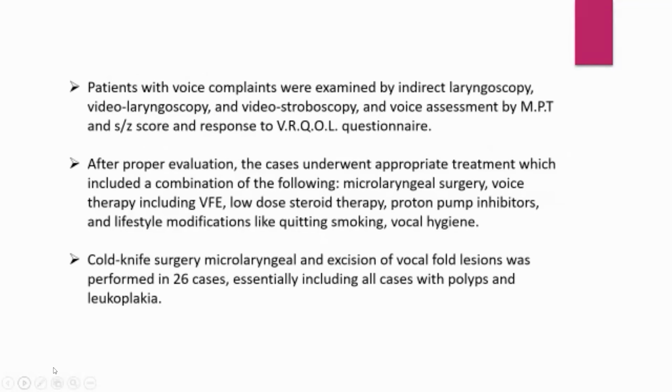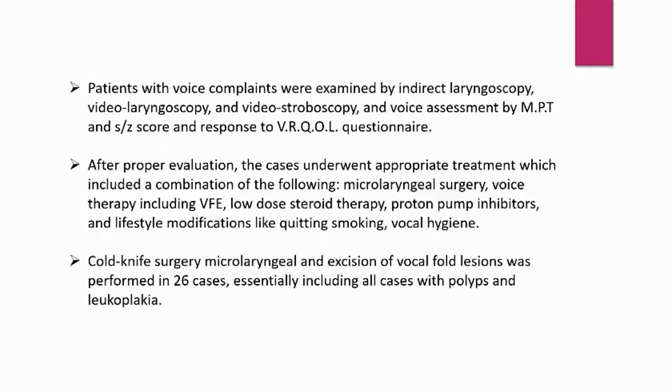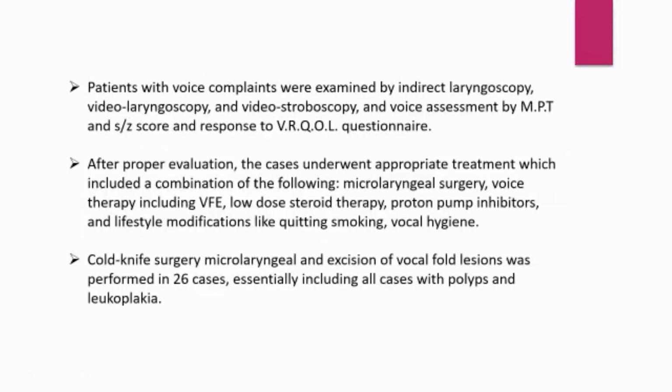Exclusion criteria included the known cases of TB and those without a response to the VRQOL questionnaire. After the proper evaluation, they underwent the treatment, which included a combination of microlaryngeal surgery, voice therapy, and lifestyle changes, in cases with vocal polyps and leukoplakia.